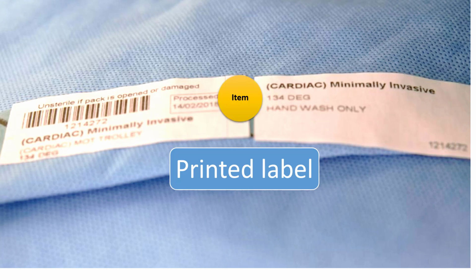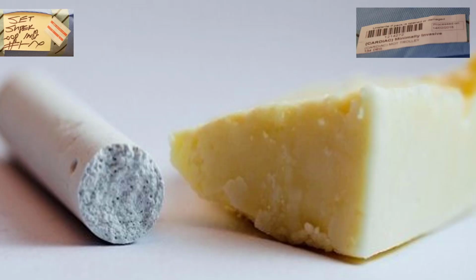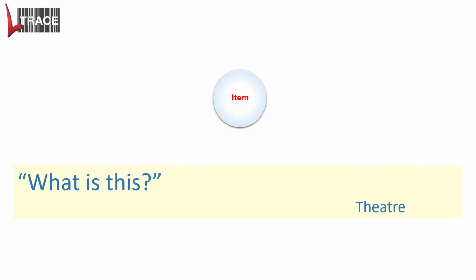What we're doing now is moving away from that handwritten label and going to a printed label. And really at this stage, what I'd have to say is it's chalk and cheese. The difference that it makes is absolutely huge, and here's some of the differences. First of all, what is this? You've got rid of that handwritten label that can't be read in some cases, and now you've got a clearly marked legible label so everyone knows what this item is without actually having to open it.